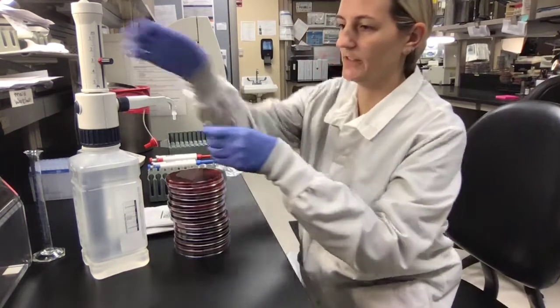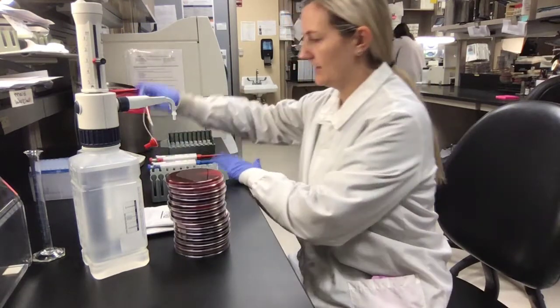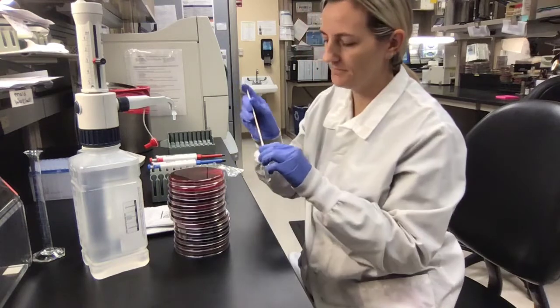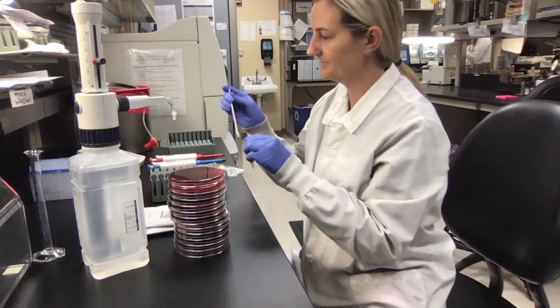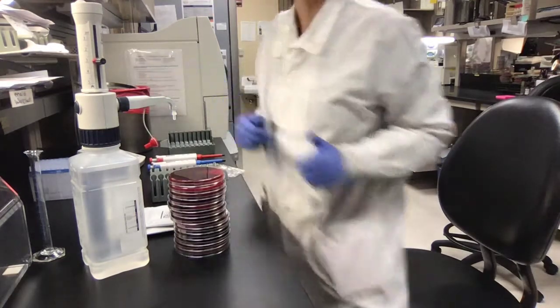The first thing we need to do is get three milliliters of saline and make a McFarland. You just take a little bit of the organism, put it in the saline, swirl it around, and then test it to make sure that you have a 0.5 McFarland. As you can see, it is a 0.5.